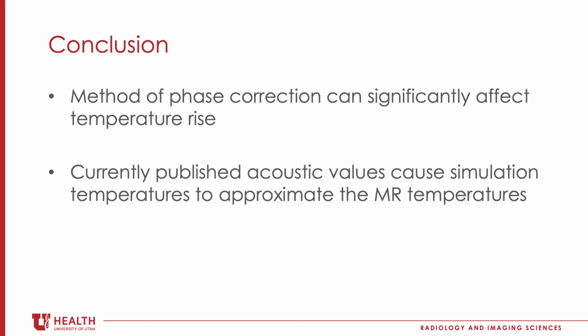In conclusion, we found that the method of phase correction can significantly affect the temperature rise. Also, based on the temperature rise seen in the clinical simulation and clinical MRTI, the acoustic values are matching, given how similarly the temperature rose together and the similar peak temperature.